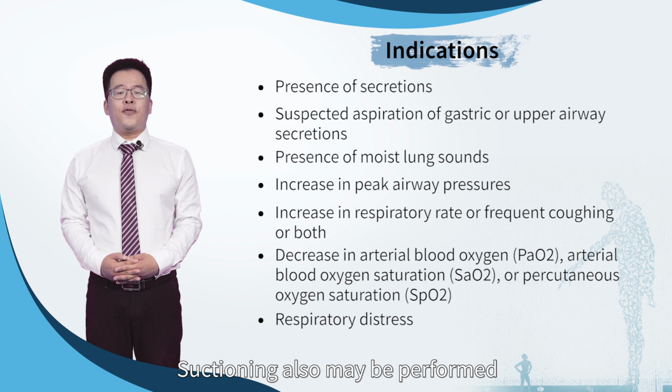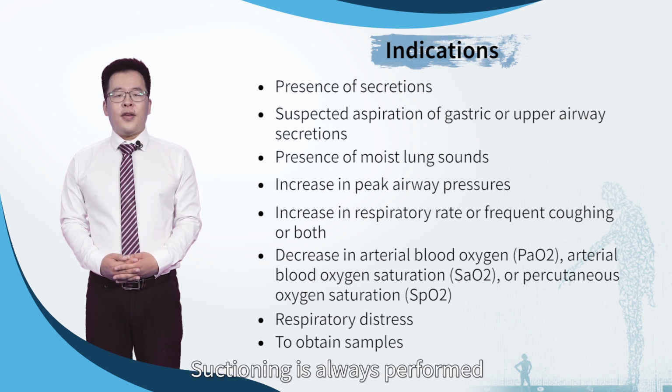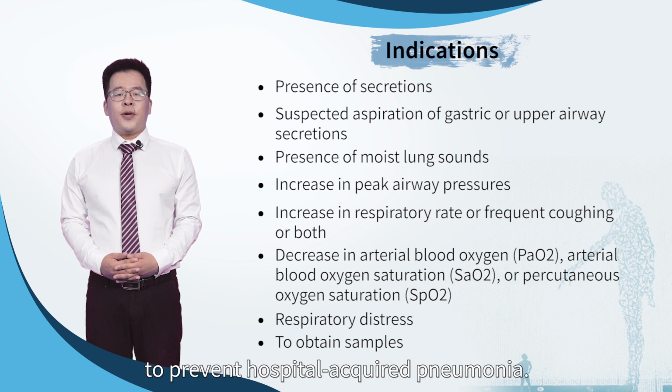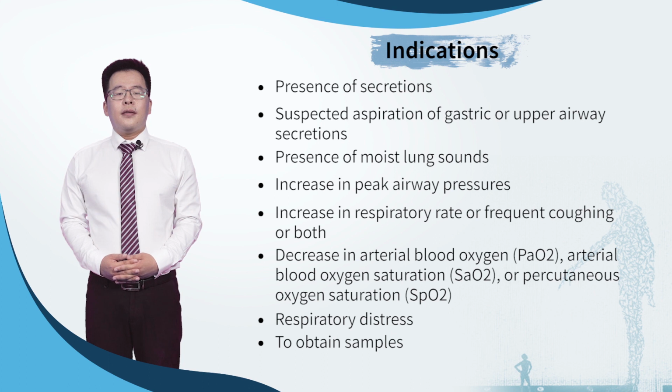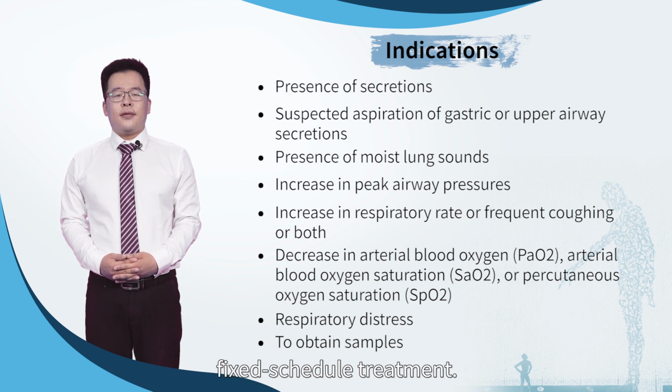Suctioning also may be performed to obtain samples of tracheal secretions for laboratory analysis. Suctioning is always performed as a sterile procedure to prevent hospital-acquired pneumonia. Suctioning of airways should be performed only for a clinical indication and not as a routine fixed schedule treatment.